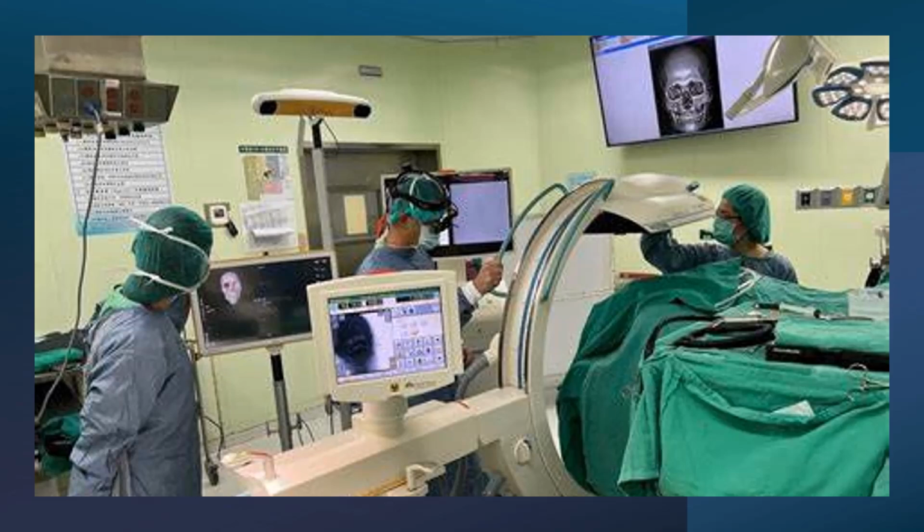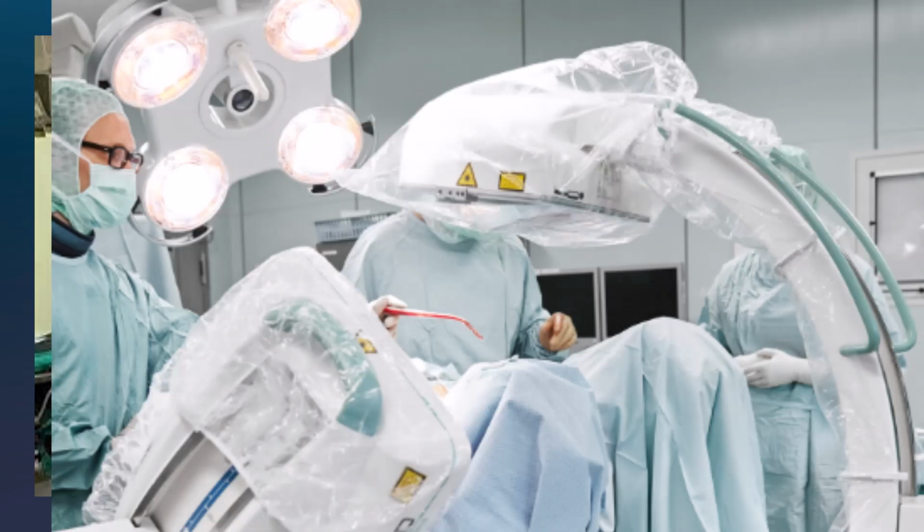In intraoperative surgery, the C-arm is a crucial tool used, especially in orthopedic and trauma surgeries. However, positioning the C-arm for standard projections can be challenging due to a number of factors. One, obviously, would be the variability in the patient's body habitus. Two, it is challenging to view the internal organs when we cannot see them from the outside.